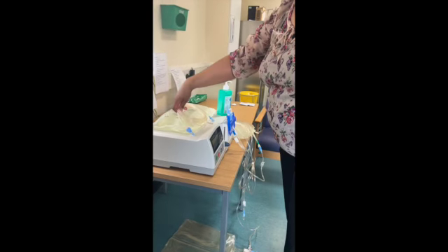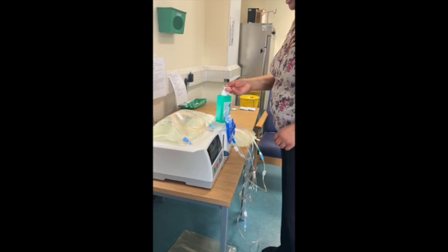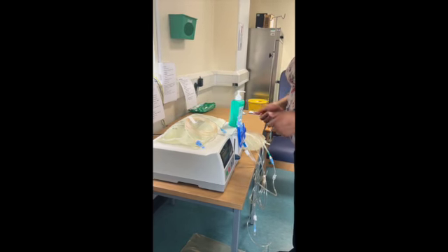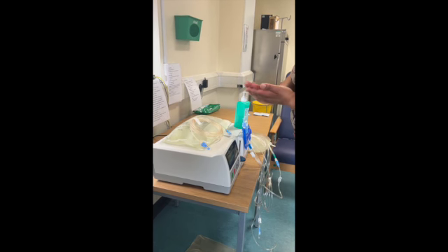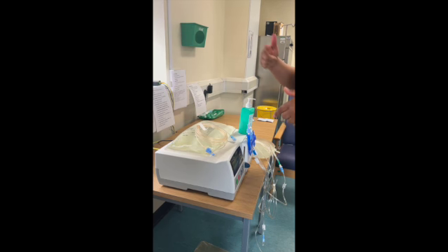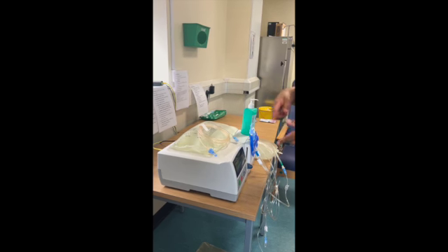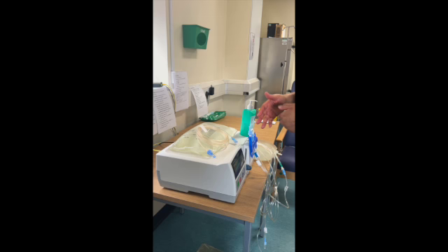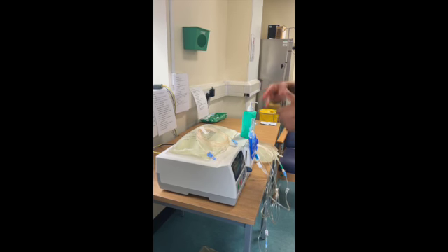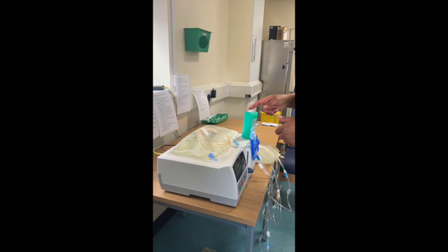I'm now going to gel my hands before I connect the extension to the patient line. And the reason why I've got the extension is to make it easier to go to the toilet during the night, because I don't want to have to disconnect and reconnect, which puts me more at risk of getting infection. So this enables me to use the toilet without having to disconnect from the machine.